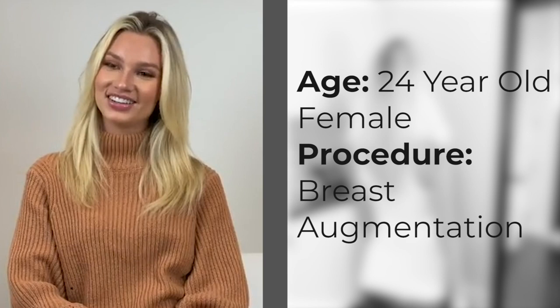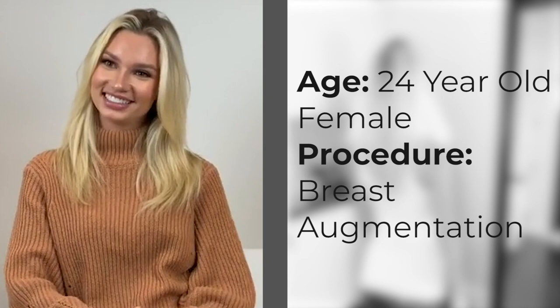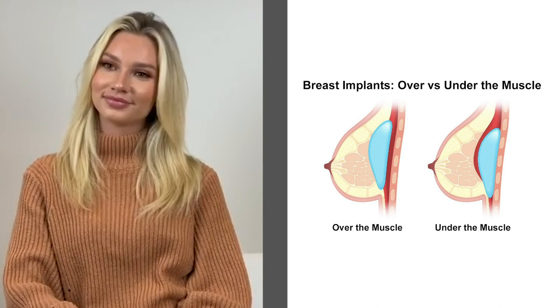Alexa, welcome to the office again. We're here at Pharma Plastic Surgery and we're going to discuss your upcoming surgery. What we're going to be doing is breast augmentation and we're going to be using a silicone implant.